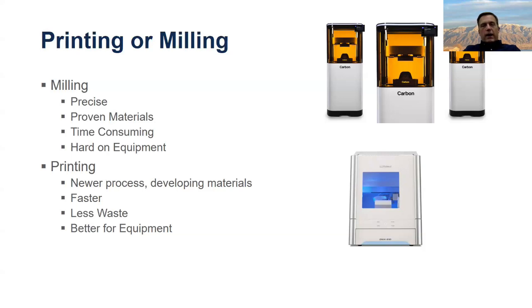Talk to your lab, but I think you'll find that most of your labs are milling, and the new milling materials just work great for you and your patients.